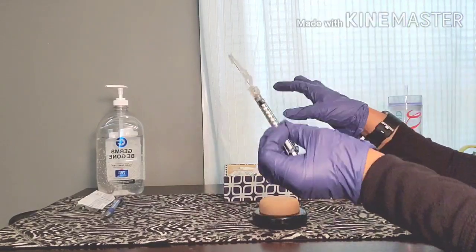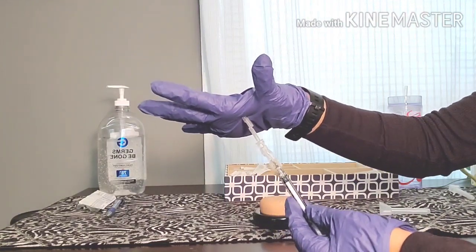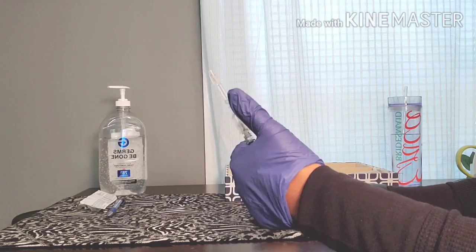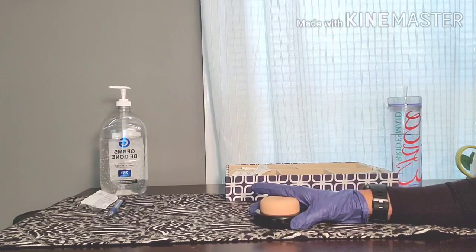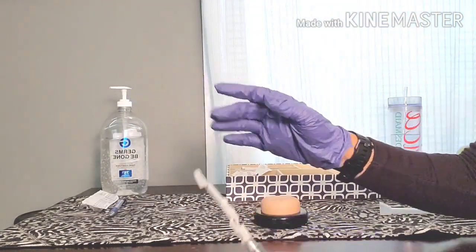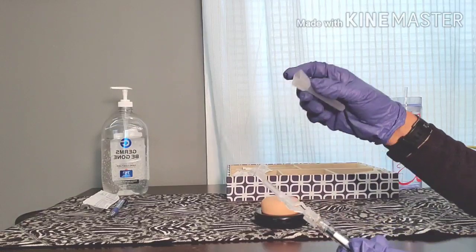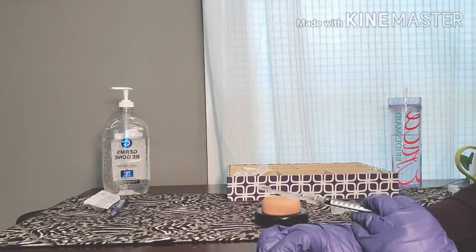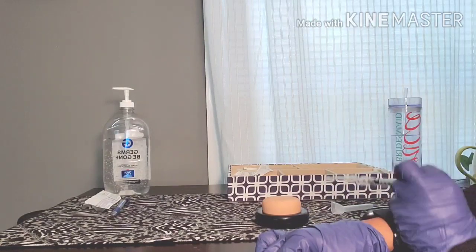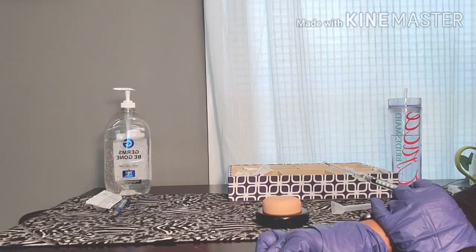With a one-hand approach, I activate the needle safety and insert the syringe and needle into the sharps container. The important thing: never bring your other hand over to activate the safety — that's very dangerous. Use your thumb or the guardrail to activate it, and never recap a used needle. Then grab a gauze, place it on the patient, hold firm pressure if it's bleeding, or put a band-aid on. Finally, document the site you chose and come back to reassess your patient for pain relief.